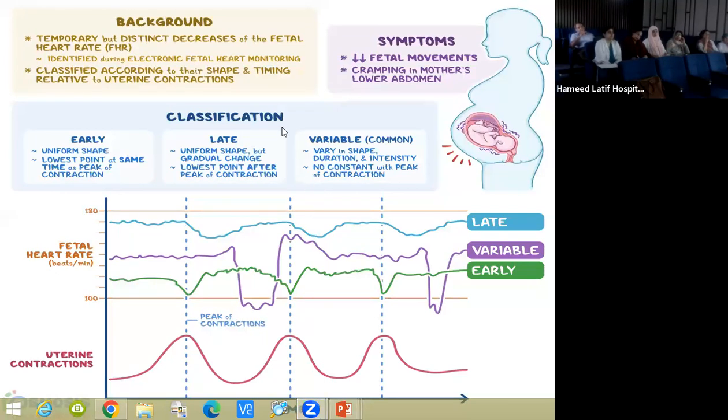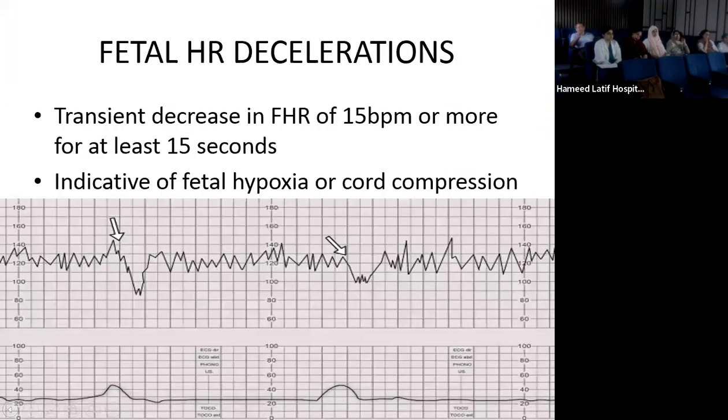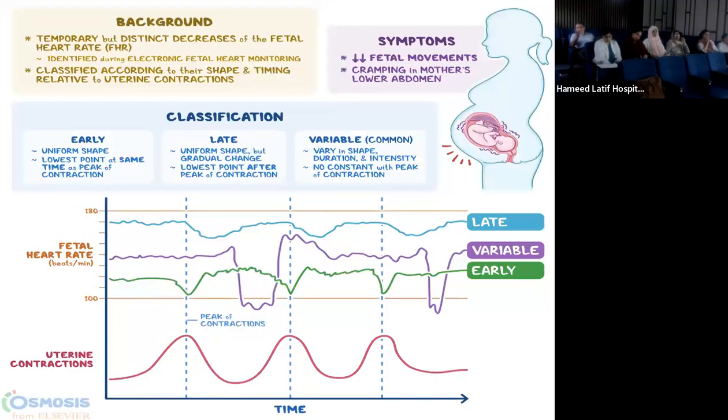The early decelerations can be physiological because the baby is doing well. You don't need to act. You just need to make sure it doesn't happen. Okay? Continue, madam. Thank you.